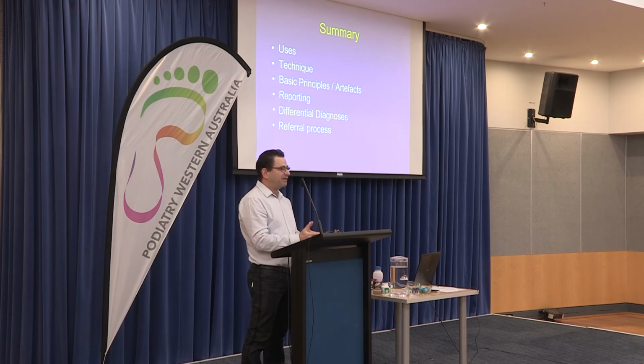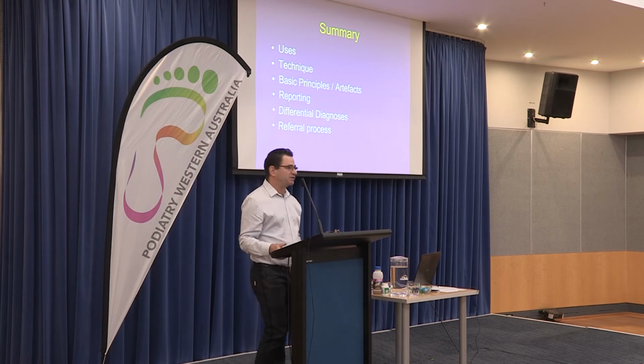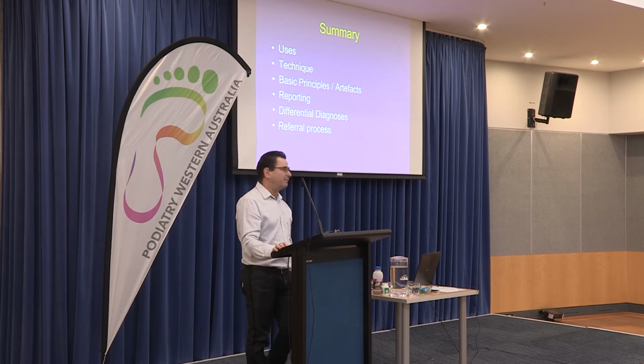But there's no doubt there are some things that MR shows better. So MR will show muscle strain better. If you've got a plantar fasciopathy, everyone who has plantar fasciopathy, we will look at the abductor digiti minimi to look for denervation change for a neuropathy type thing. We see that at ultrasound, but you see it better at MR.